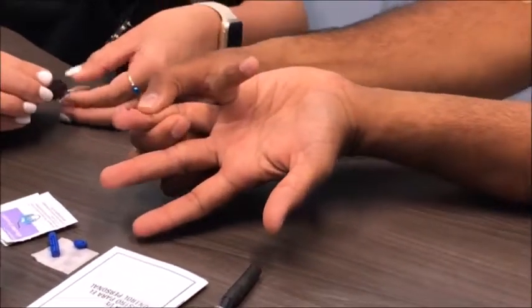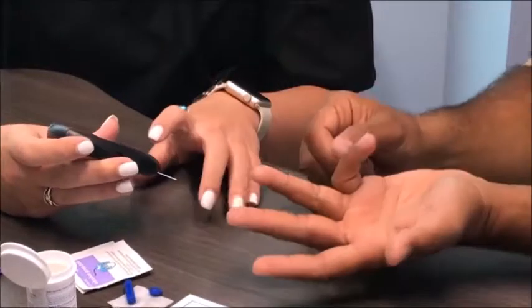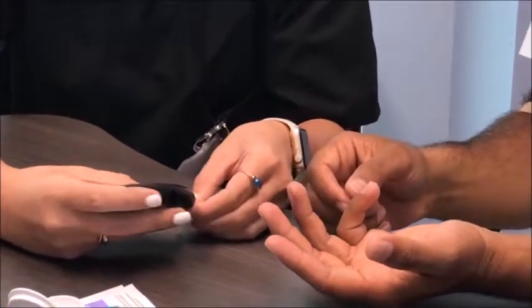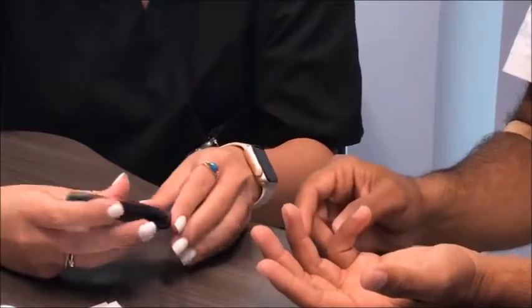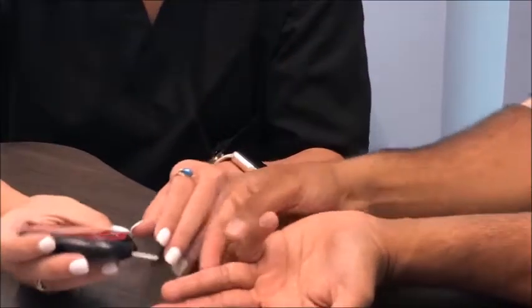Does it matter how much blood? Normally the monitor will tell you, but you don't want too much, and you're going to want to wait until there's an icon that says blood. Let's see. It'll have a little blood droplet on here, like that. Yeah, like that.